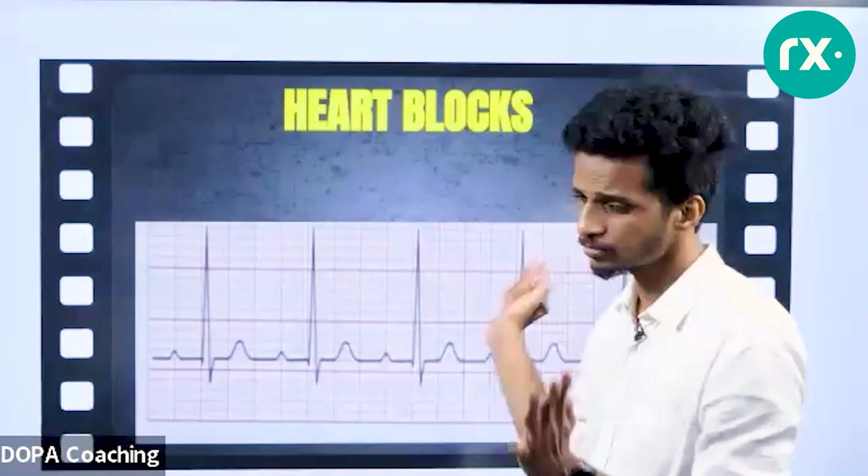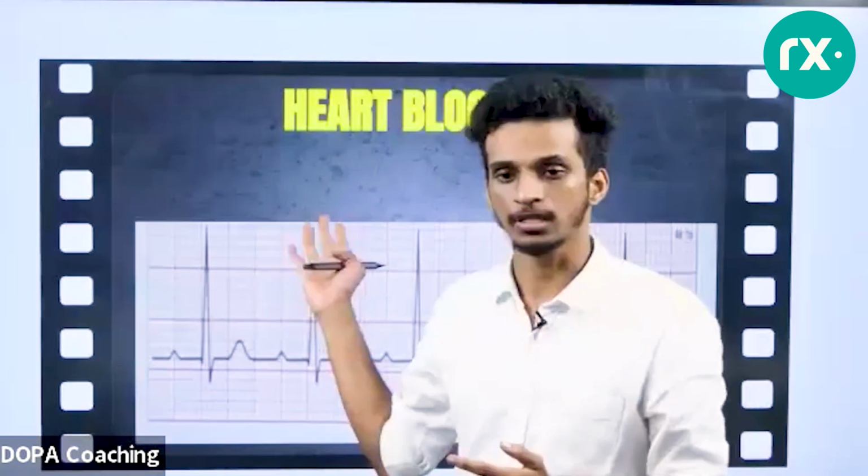Now I have left many things, I have many things to discuss. And importantly, I have also discussed LBBB, because LBBB also presents as an acute emergency. So these arrhythmias, changes in MI, and LBBB were the most important topics, and these are the most acute emergencies that you should pick up in an ECG. With this session, I just planned to discuss these topics only. If time was allowing me, I would have discussed more, but the most important things I really wished to discuss today, I have already discussed.